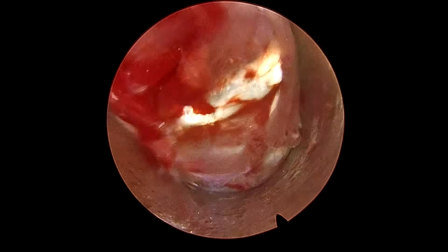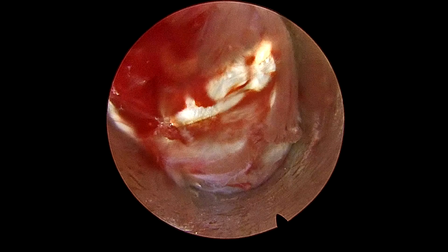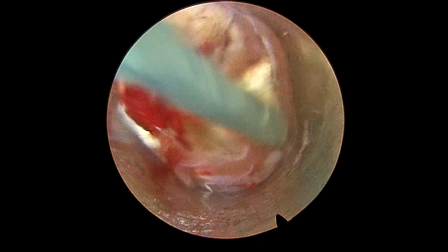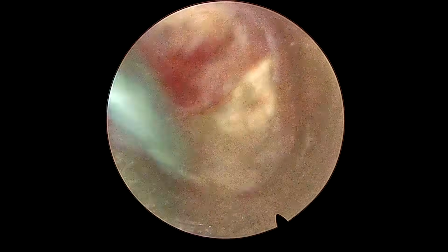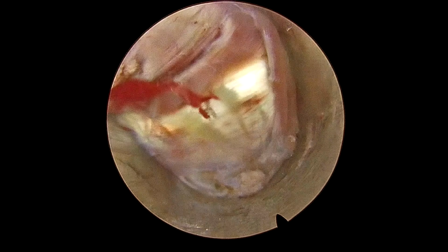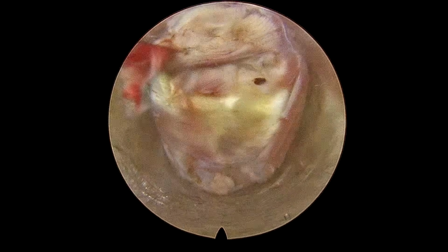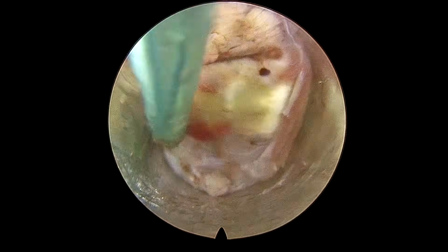So this is the endoscopic view. The moment you insert the endoscope, you are going to see the soft tissues over the interlaminar window. So try to coagulate even the smallest vessels here. Whenever you see any vessel, try to coagulate those vessels right away.